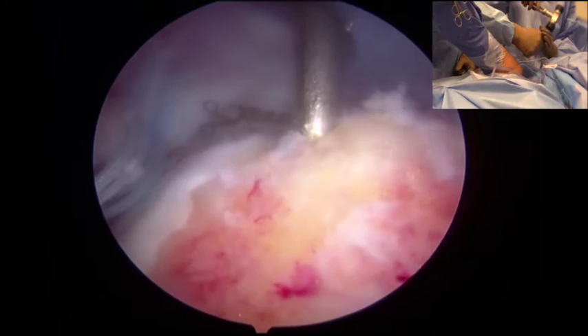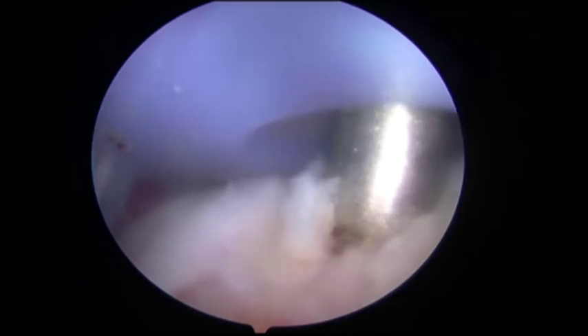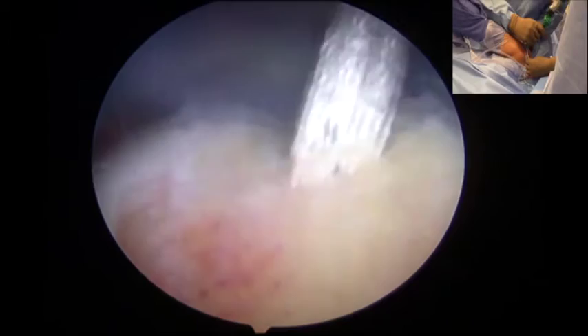Utilizing a cannula, the first greater tuberosity footprint anchor was delivered at the margin of the articular surface and the greater tuberosity. This was followed by placement of a single-loaded, heavy-threaded suture and anchor.